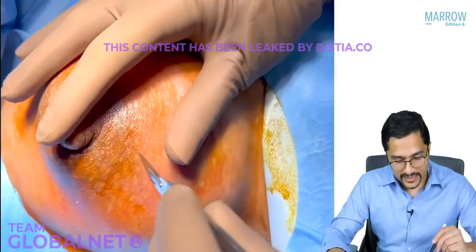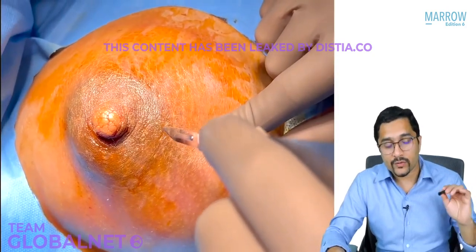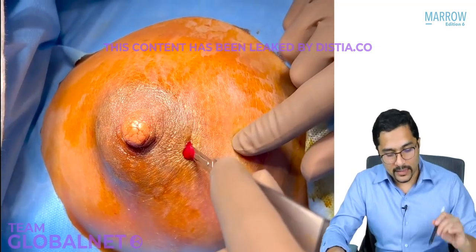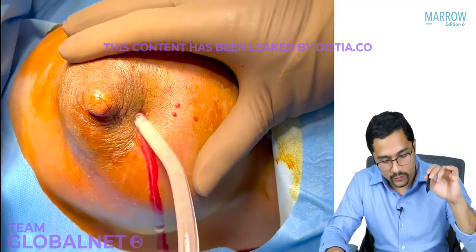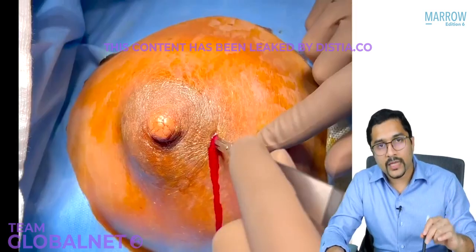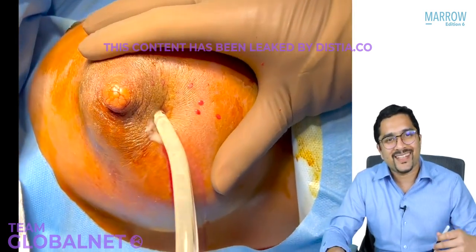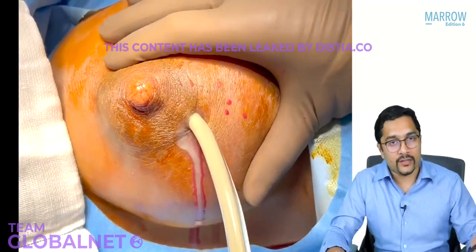I'm putting my blade perpendicular to the skin, and I'm going to go from my right to my left. Now you can see I have the number 11 blade in my hand, which is a pointed blade used for incision and drainage. This was a lady with a breast abscess. At the point of maximum tenderness or fluctuation, I'm going to make a stab incision there. Once I do that, first some blood comes out and then you can see that pus has started coming out. So this is used for incision and drainage or arteriotomies.